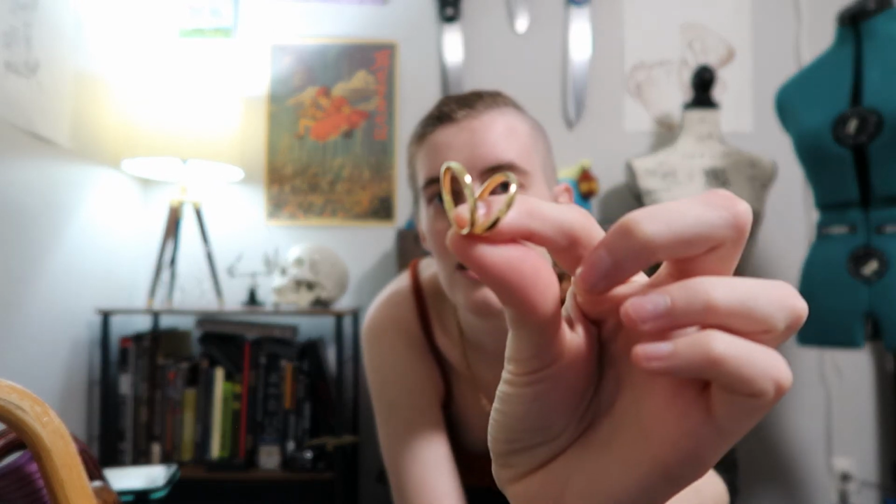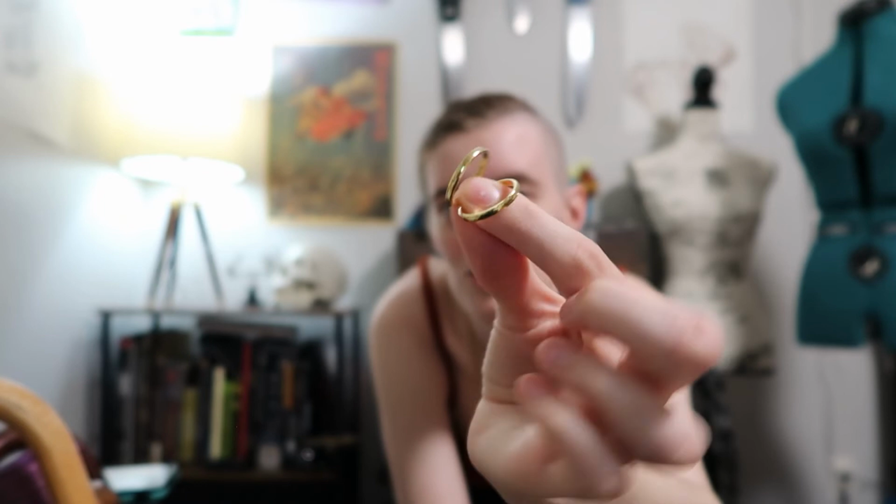So the last things I want to show you, I've been really into, and I've been having to stop myself from buying a bunch. I've been very into rings lately, and I found these. I buy most of them from Etsy because I like to get handmade stuff when I can. I see these called arthritis rings a lot, or if you have Ehlers-Danlos. But they're also called finger splints, or joint support rings. Before I put them on, they're two rings kind of put together. So they look like this on the inside of your knuckle, and it's a support that keeps your finger from being able to bend all the way.